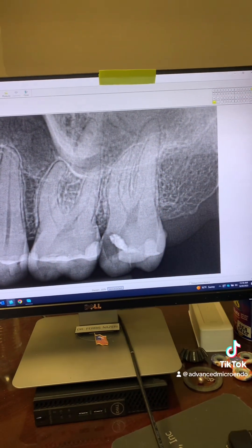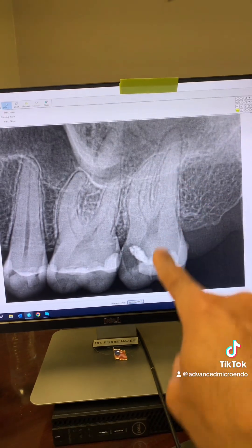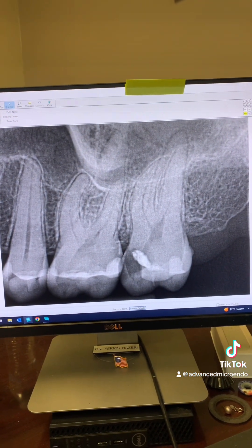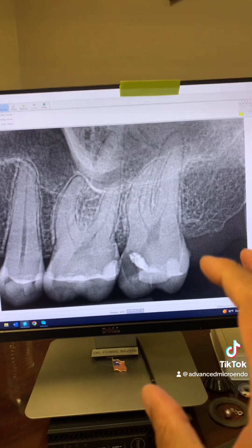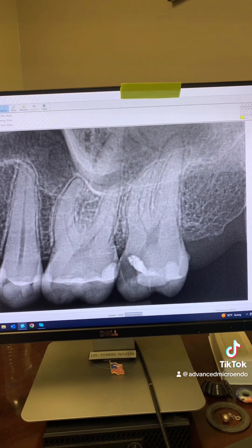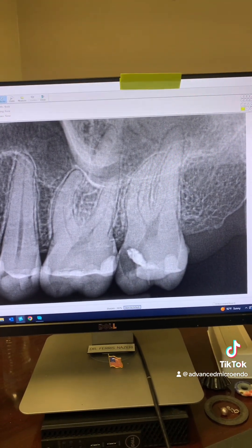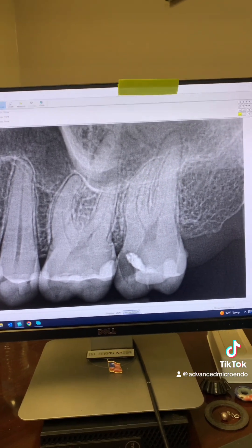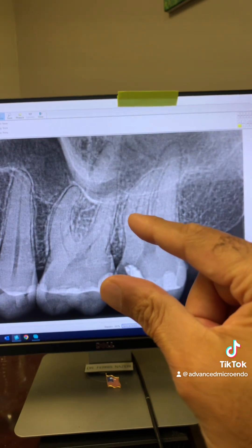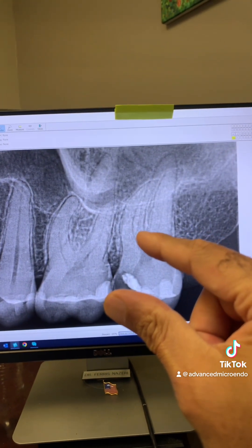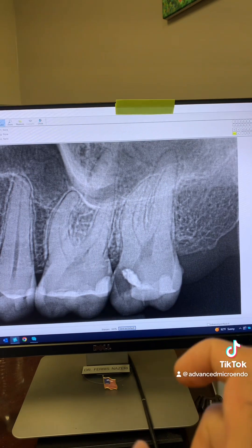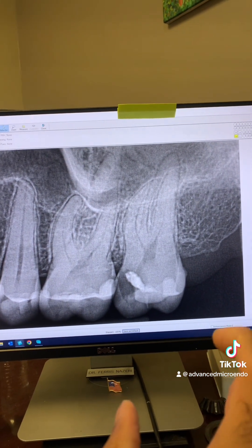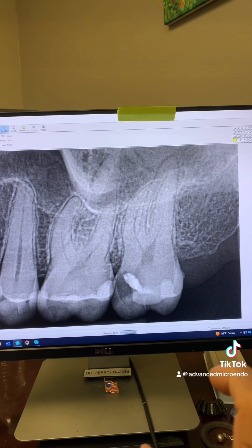This 29-year-old female patient was referred to me for endodontic treatment of tooth number 15. She had TMD, so she had a very, very hard time keeping her mouth open. We tried a child-sized bite block, and she couldn't even handle that. She could only open this much, and every few minutes I had to give her a little break. She would literally dislocate her jaw when she would open it — you could hear it, you could see the jaw move forward and get dislocated.